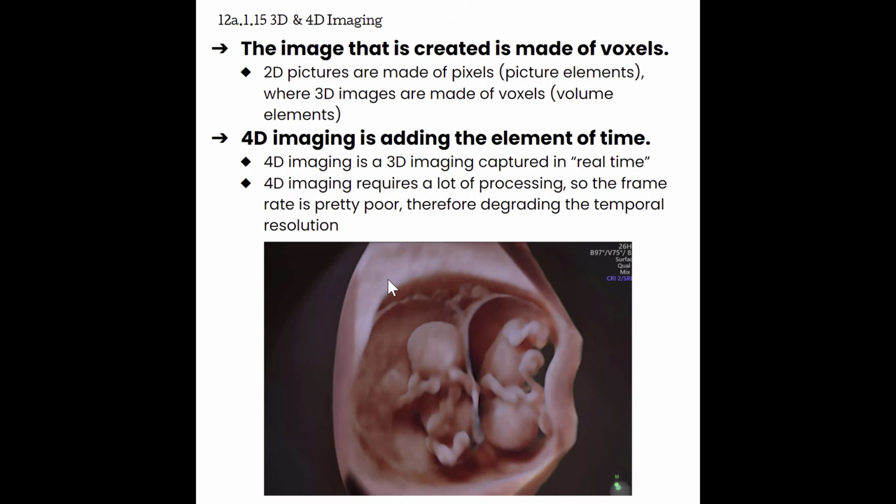However, most people think of 3D imaging as being the cute baby pictures that we see. While it is a very fun and heartwarming experience for parents to see their unborn children in 3D imaging, basically what the machine is doing is just calculating the volume of the baby, and then it does this thing called rendering, where it kind of interprets all of that information and then puts an overlay over it to make it look like soft tissue.